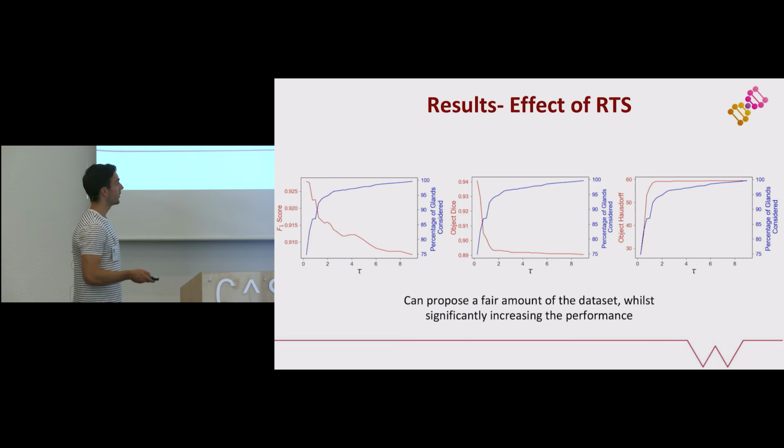So it makes sense that the higher the uncertainty threshold, the more glands remaining within the data set, but it won't be as destructive in terms of removing those glands. And then if we have an uncertainty threshold around 1, we are still able to keep a significant amount of these glands within the data set, but we can also significantly increase the performance.